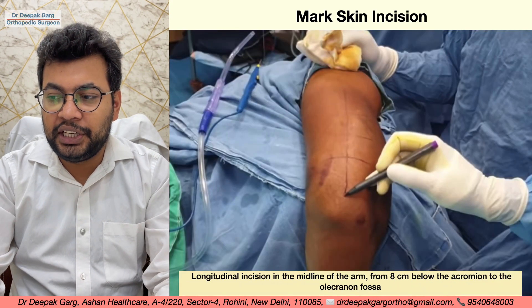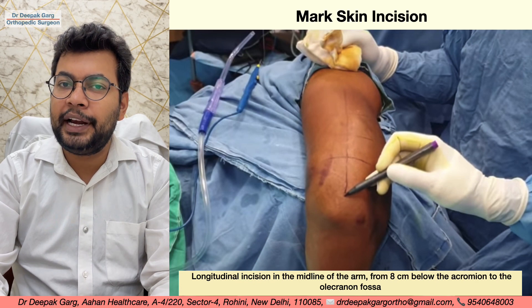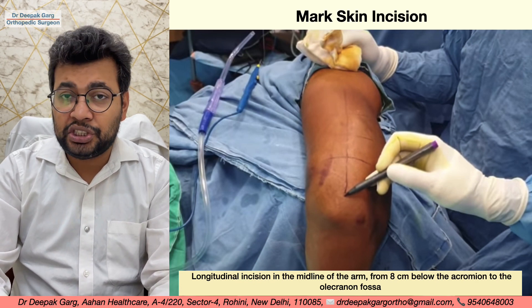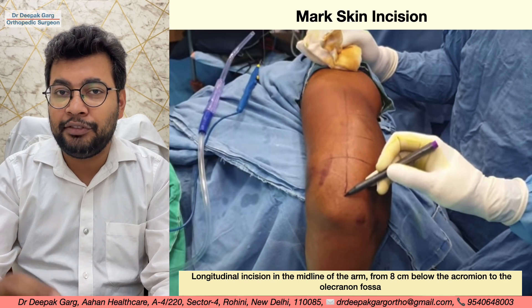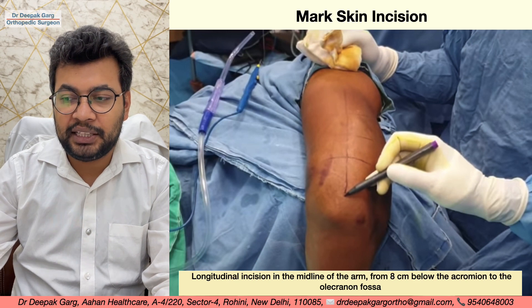We will mark our skin incision. This is a longitudinal incision in the midline of the posterior aspect of the arm. We start from 8 cm below the acromion and go till the olecranon fossa.